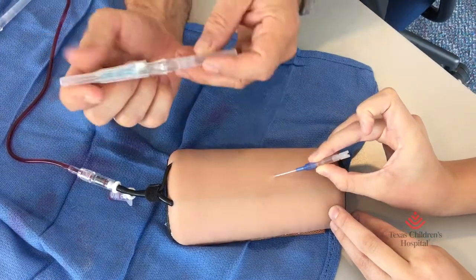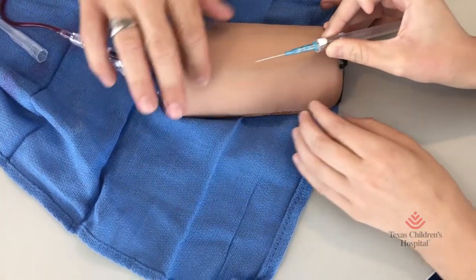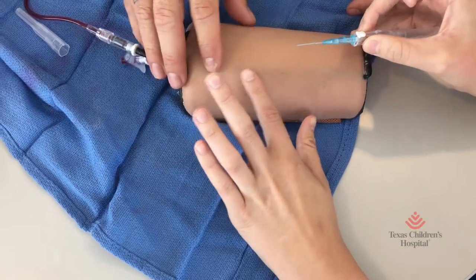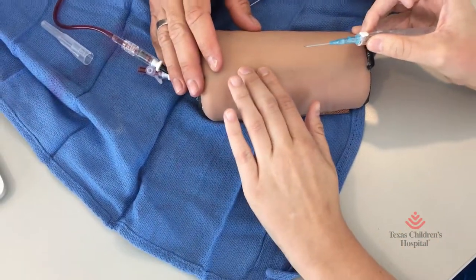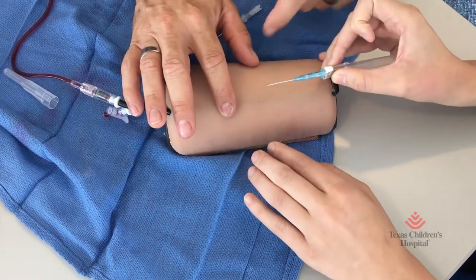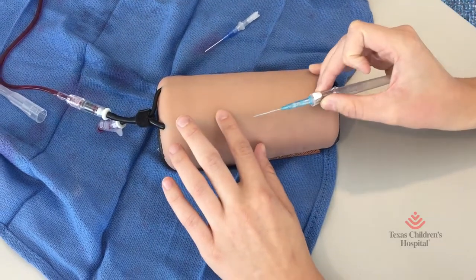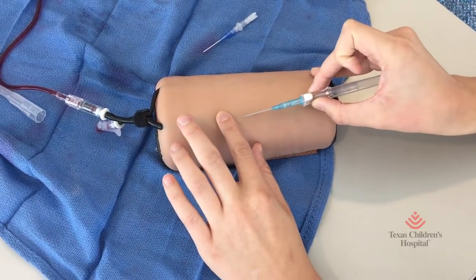Let's hit that vein. It's not a matter of shoving it. So just keep trying that — you can use this hand and kind of feel that vein. Then we'll move over to the other one and go to a smaller one. Use as much sense as you can — you're feeling that with that finger. Kind of let that finger guide the tip of that needle where to go.